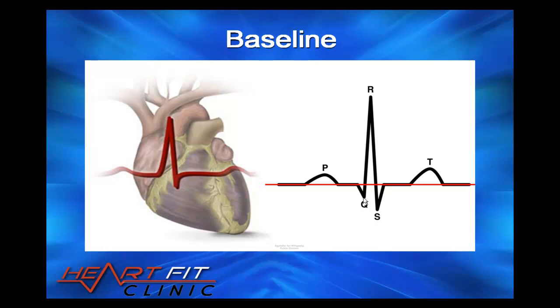Now, sometimes there are ST changes that are not significant, meaning it happens because of medications or an underlying arrhythmia, such as left bundle branch block or left ventricular hypertrophy or even right bundle branch block. But either way, this is something that your healthcare team will and should further investigate with further diagnostic tests. A usual course of action will be an abnormal ECG, then onwards to a stress test, then maybe a possible perfusion scan, and if that is positive or at risk, then it will send you onwards to an angiogram.